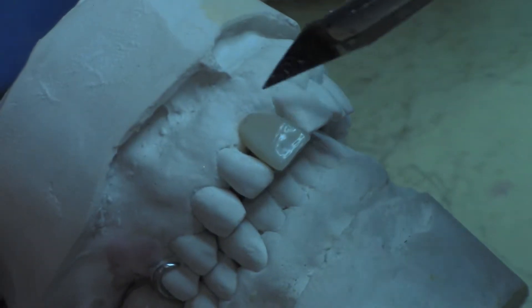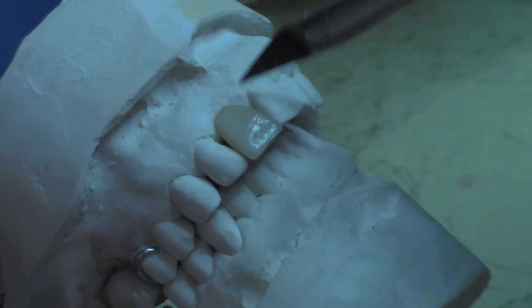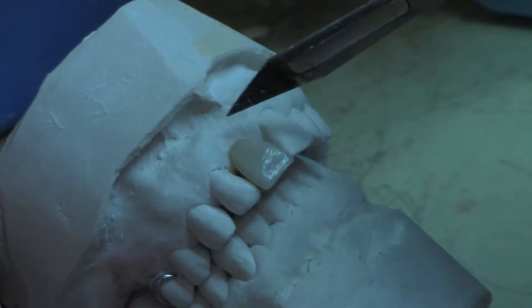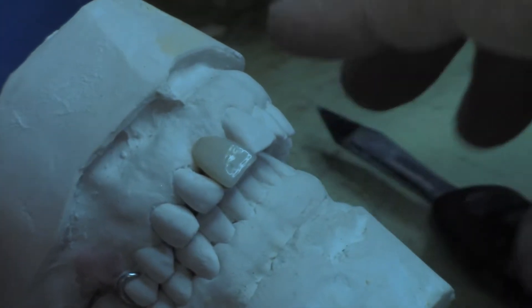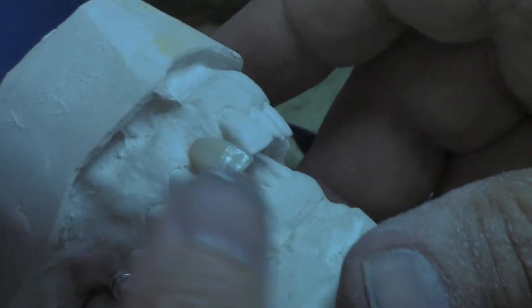I'll probably have a little bit to finish around here. I'm going to butt this tooth against the tissue, but I could actually add a saddle also if need be.